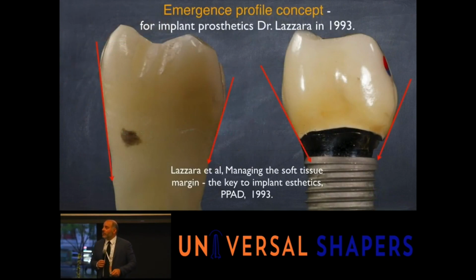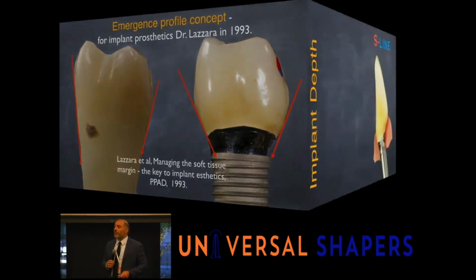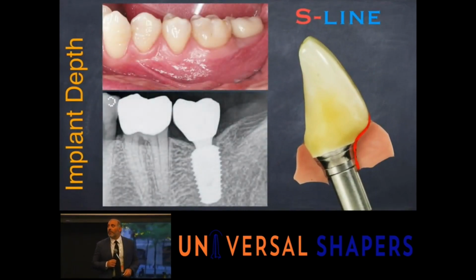So this type of emergence profile that they discussed, they compared this one, and it had some okay success, but it wasn't enough of a shift. When we changed that design to give it more of an S-line type of shape, that's when we start to see better peri-implant tissues. And it stands up to the test of time. And this is from the article from Lazzara.